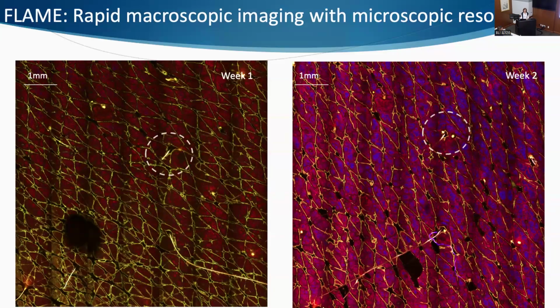They are acquired at slightly different depths, but again, that's not a problem. How do I know it's a slightly different depth? Because we have some blue color showing up here. That's second harmonic generation from collagen. So you're a bit deeper into the dermis in this one.